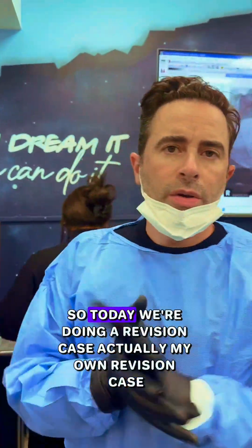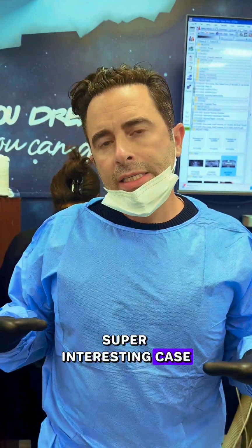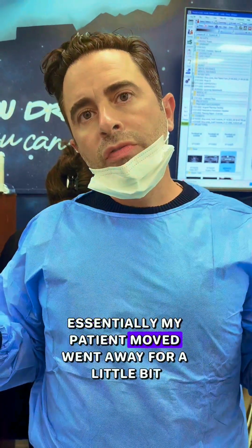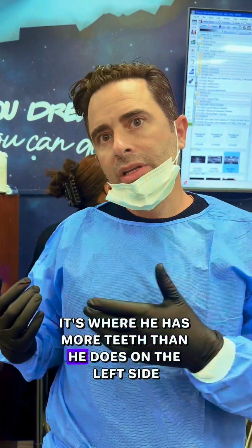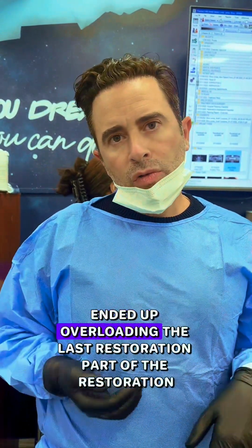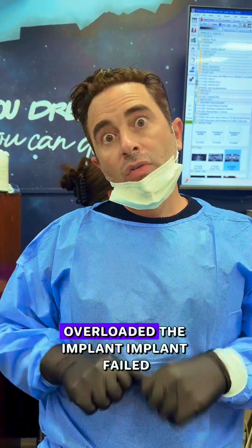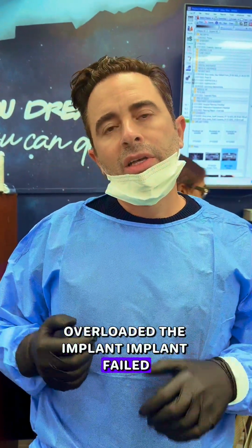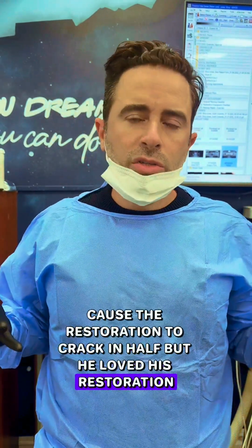All right, so today we're doing a revision case, actually my own revision case. Super interesting case. Essentially, my patient moved, went away for a little bit. Upper right side is the biting side. It's where he has more teeth than he does on the left side. Ended up overloading the last part of the restoration, overloaded the implant. Implant failed, caused the restoration to crack in half, but he loved his restoration.